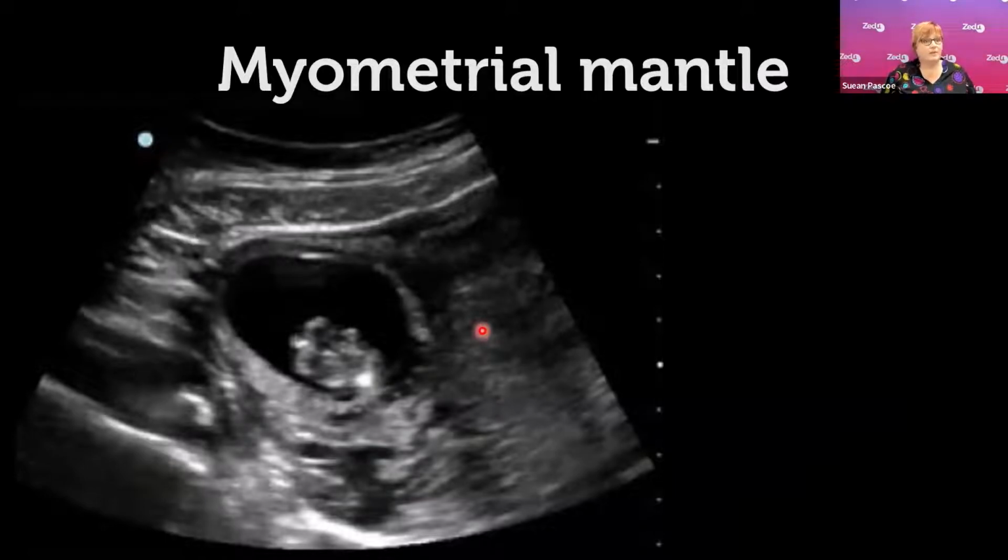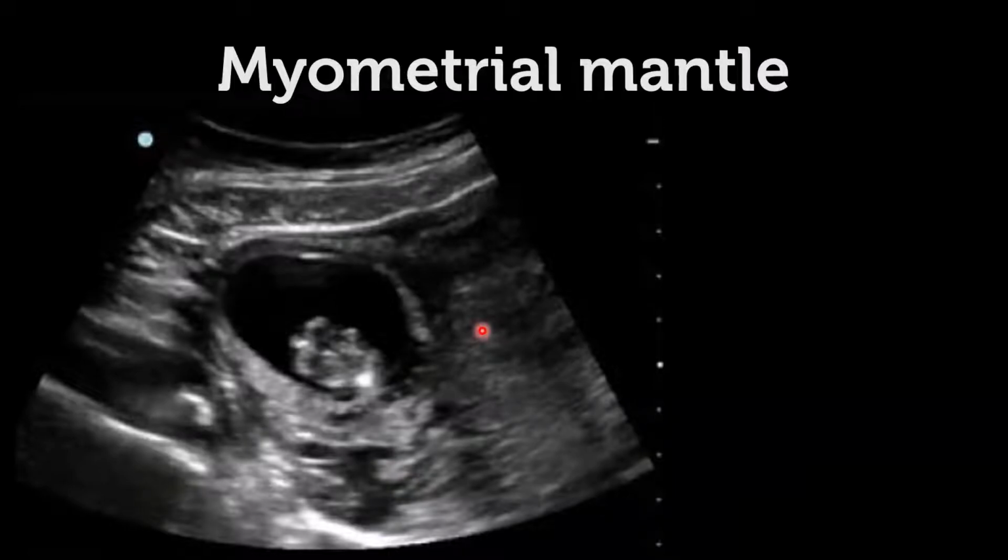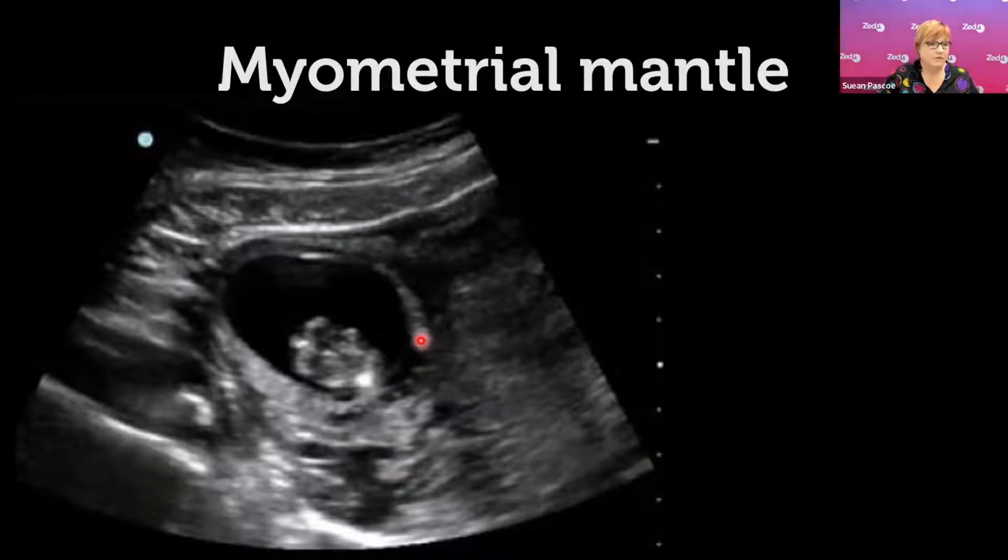Now, ectopics can also implant in ectopic locations within the uterus, either in the cervix or in the cornu or the interstitium of the uterus. You can see this example. This lady happened to present at her GP on a day when someone was there doing applications training, and a very experienced sonographer with very good technique was doing the scan. I think otherwise it could possibly have been missed, but this lady was gravida 6, para 5, and we saw this 10-week gestation sitting right up in the cornu of the uterus.